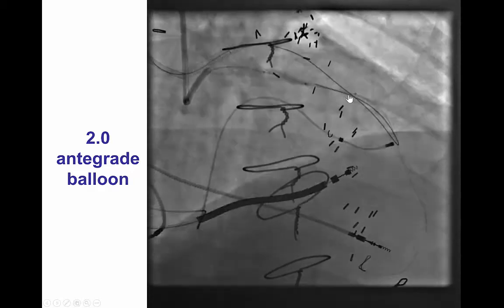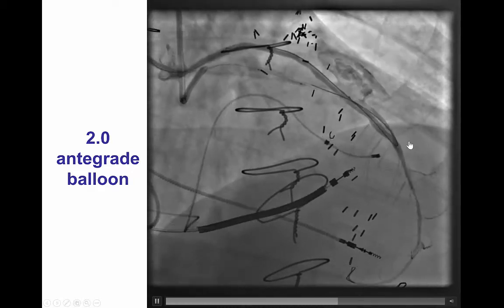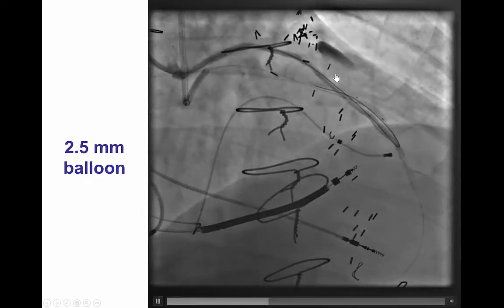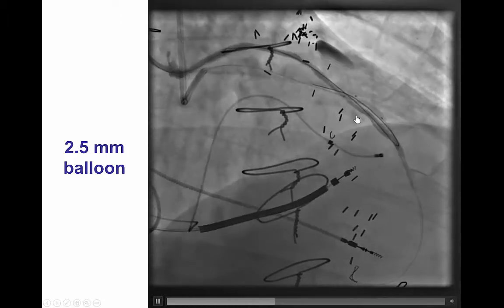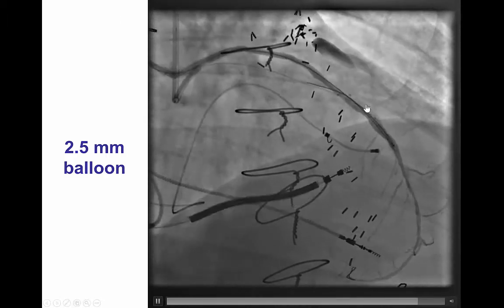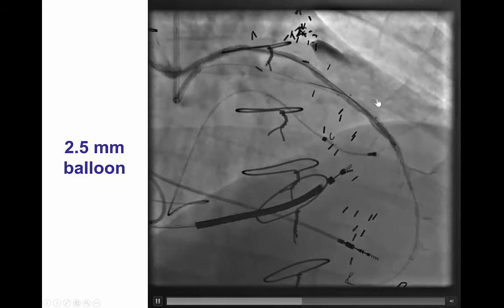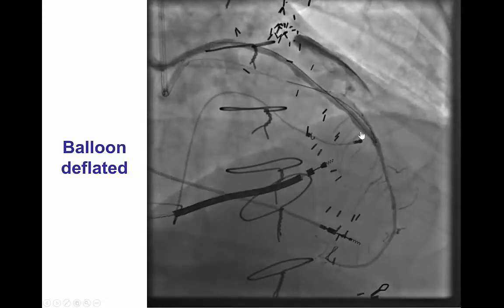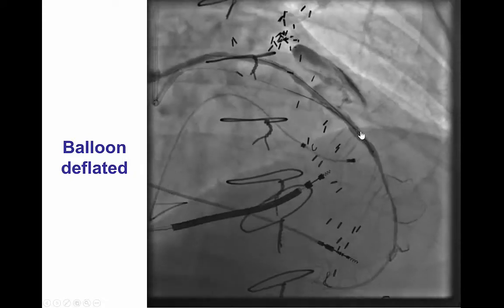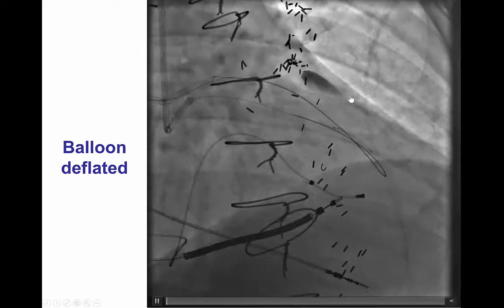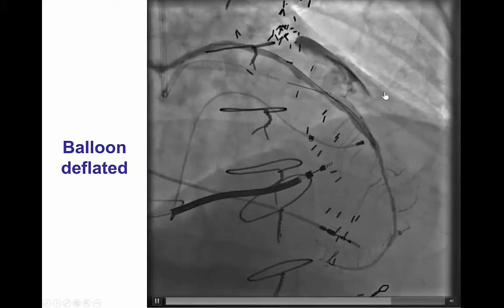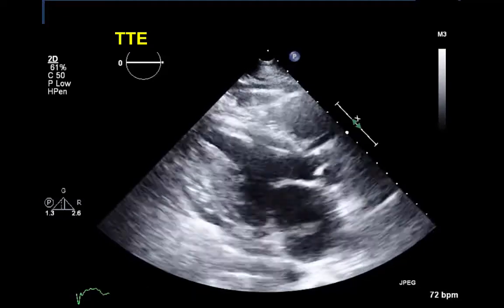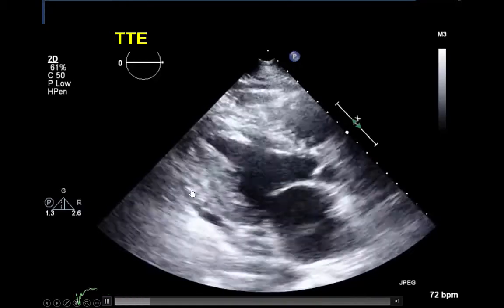A balloon was inflated proximally, but we remembered that the patient had excellent flow through the vein graft, so he was still bleeding retrograde via the vein graft. We had to get a larger balloon and place it immediately on top of the perforation, which sealed the perforation and stopped continued bleeding into the pericardial space. After several minutes we transiently deflated the balloon, but the perforation was still present with significant bleeding. The balloon was re-inflated, and transthoracic echo demonstrated the beginning of a pericardial effusion.